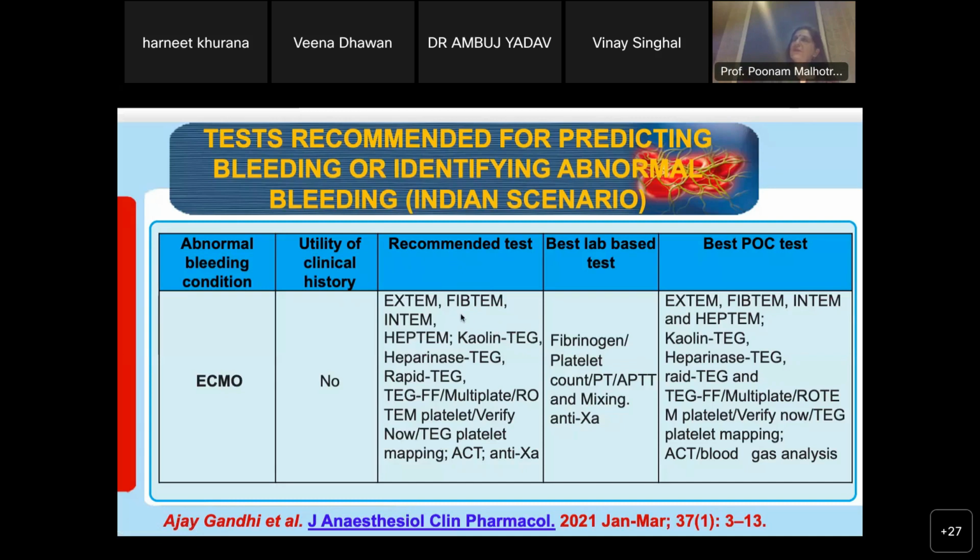This is more so for the adult patient, not for the neonates, not for the child. But when patients are undergoing a high-risk PCI with ECMO, we need to test the platelet function. So platelet function testing is becoming a norm in most cardiac ECMOs, and it is also very important to know that point of care testing, whether with Sonoclot, ROTEM, or TEG, is here to stay. And I would like to go to my next slide.